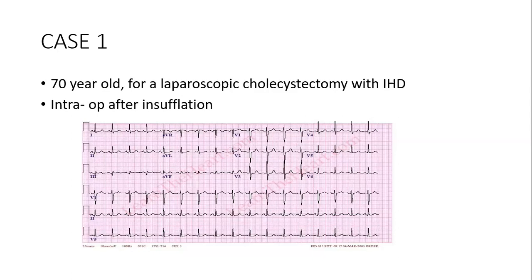So this patient might get a perfect laparoscopic cholecystectomy, but this 70-year-old might die in the next 15 days just because maybe you didn't pay attention to subtle things like oxygen supply to the heart. So this is a patient with sinus tachycardia. Your worry as an anesthetist is what Kakamba was describing, perfusion to the heart, except other things that we won't go into.